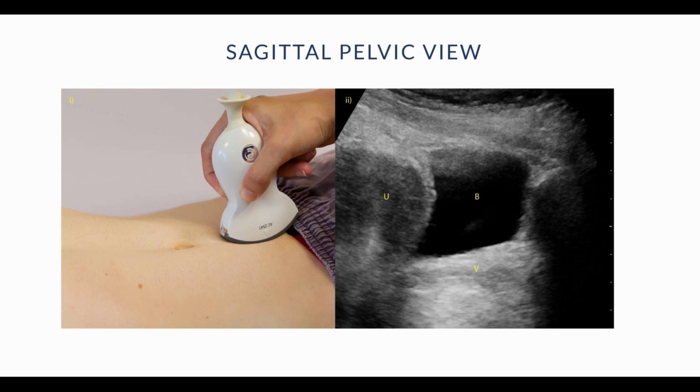The longitudinal view is acquired in the abdominal midline with the probe marker pointing cranially. Again, it is important to remember that a still image is insufficient to exclude pelvic fluid, and the user should try to systematically fan through whatever structures are identified.